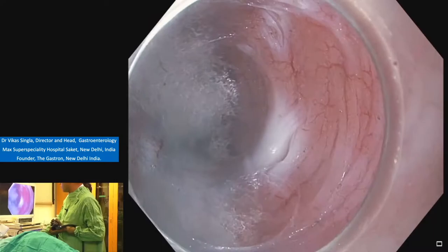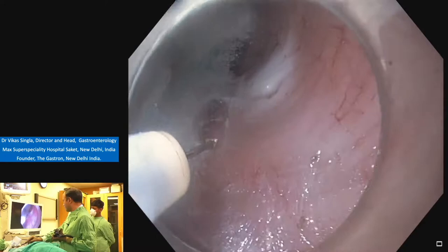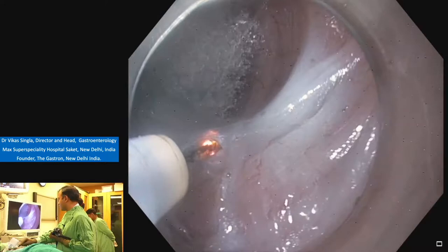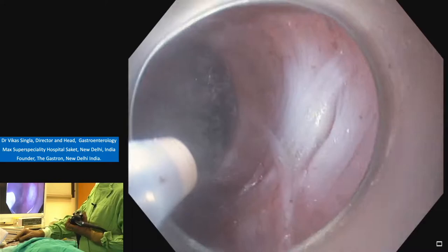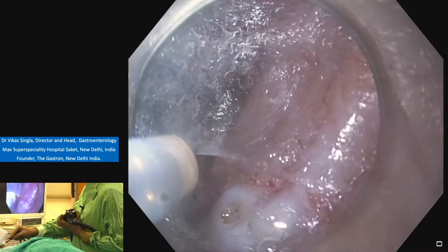So again we'll dissect on the fibers which are left behind. It is very essential to dissect these fibers, otherwise the tunnel will become narrowed. So we'll go from one side to the other side. You can see our hand movement, we are rotating the shaft, moving in, moving out. On the left side, make a puncture, go in, use the up-slope and go to the other side.